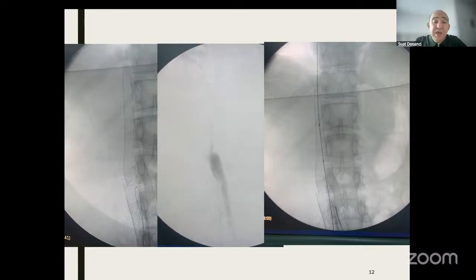And you see here that the left side was still patent, but the right side stent and the cava is occluded. I could hardly go through the sharpened part of the IVC stent, and I made balloon angioplasties, and because the proximal part of the Wallstents is very sharp, there are wires causing the balloon bursting. I think it was more than 10 PTA balloons that burst because of the sharp tips of the cava Wallstent. And at the end, we could hardly recanalize it.